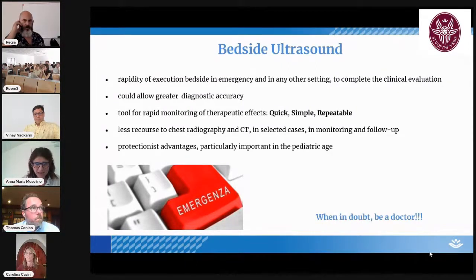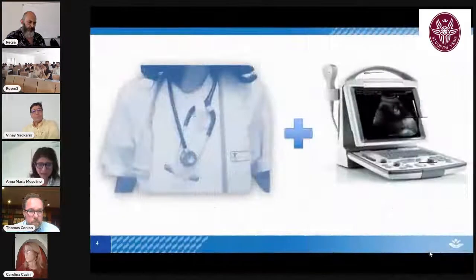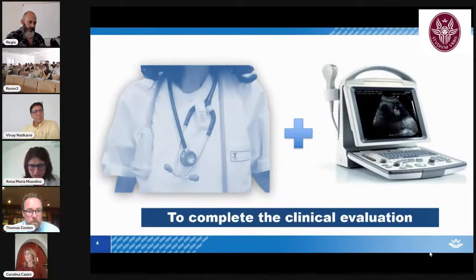And in selected cases, in monitoring and follow-up, it may allow less recourse to chest radiography and CT. Particularly important in pediatric age, radiation protection is advantageous. But it's very important, especially for the younger, that it is to complete the clinical evaluation, not a substitution.